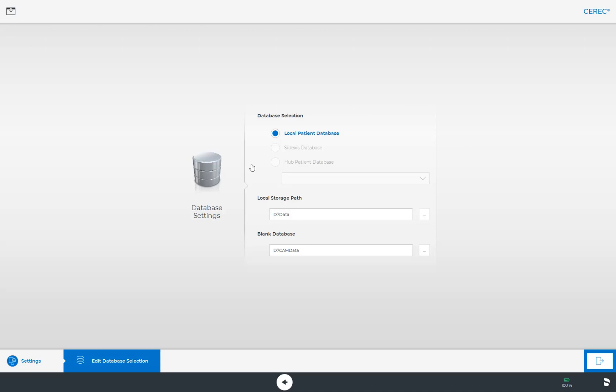Alternatively, you can manage patient data with the Sirona Sidexis software and store cases in the database created by Sidexis. The selection of the hub can also be set in this menu.